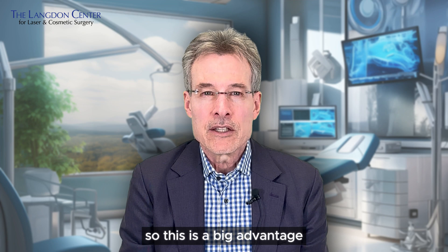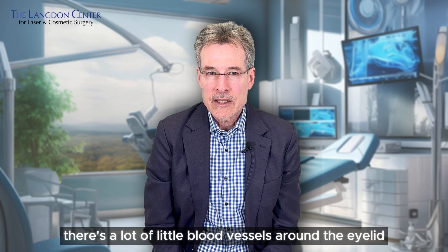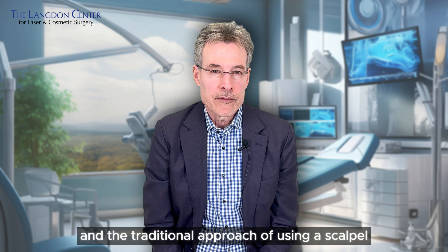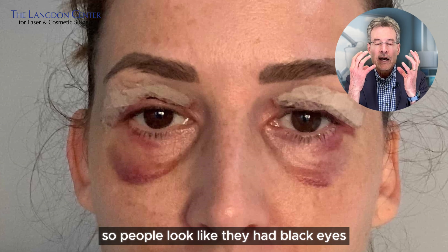This is a big advantage, especially for blepharoplasty. There are a lot of little blood vessels around the eyelid, and with the traditional approach of using a scalpel, there tends to be a lot of bruising — people look like they had black eyes.